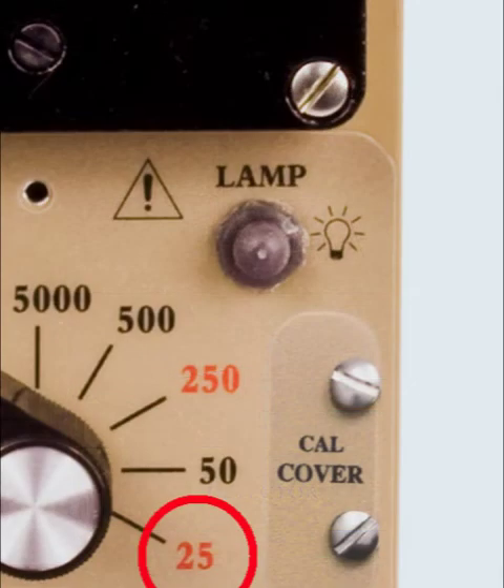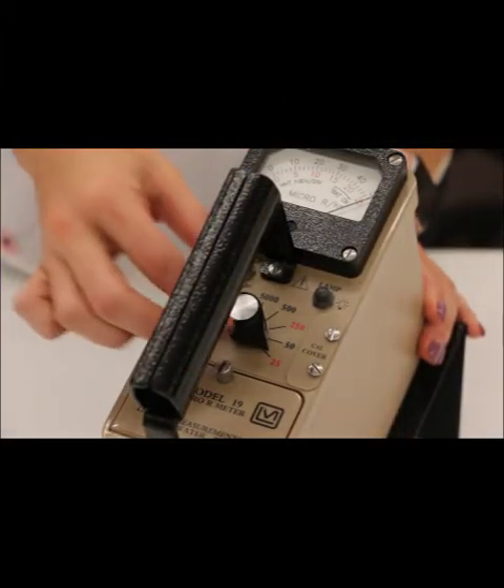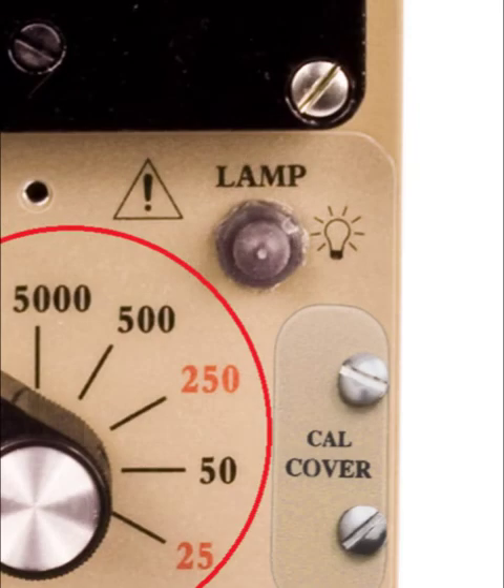As with most meters, you should start with the most sensitive range — the 25 position. If the meter goes full scale, increase the range switch to the next highest position. Repeat as necessary to get a reading. Reverse the process if the readings drop to near zero. If you have a specific point at which you make a decision, you can just use one range.